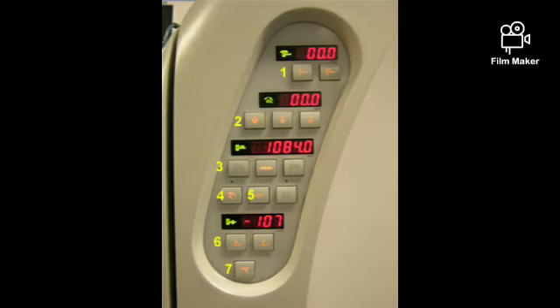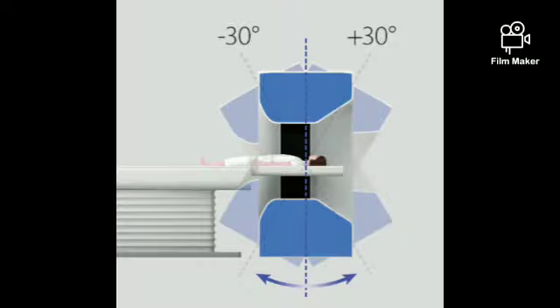I hope you can see some digits displayed on the gantry panel, and as I am saying, this is very helpful for our biopsy purposes. You can measure which direction the table is in and what the height of the table is. So if sometimes the laser lights are not working, this will also help you with your positioning. That's really useful for us.